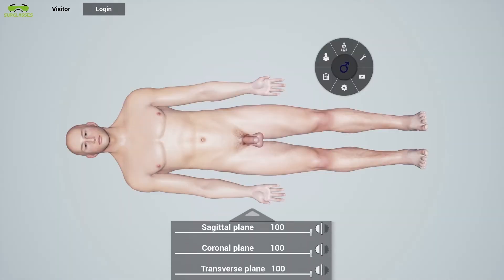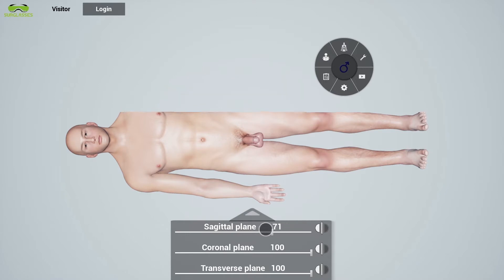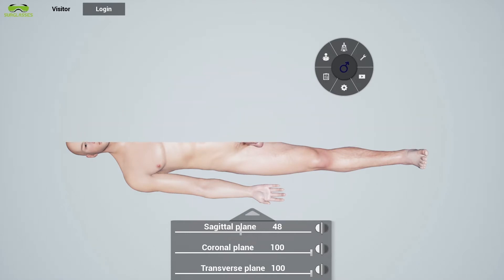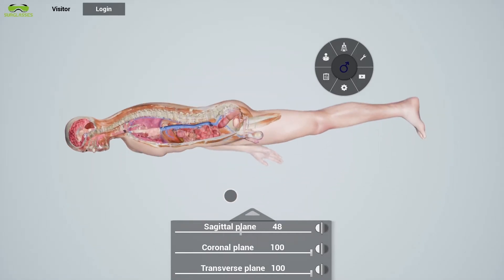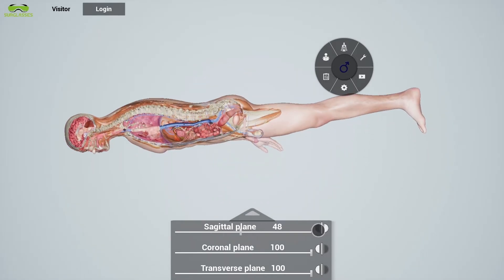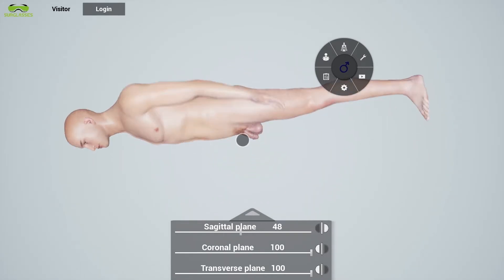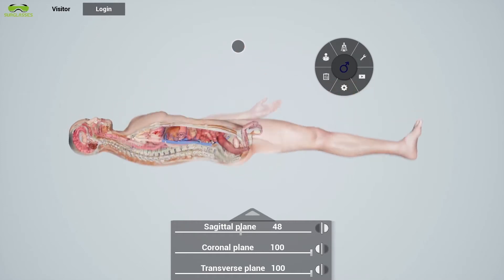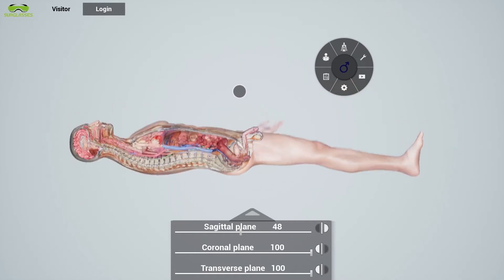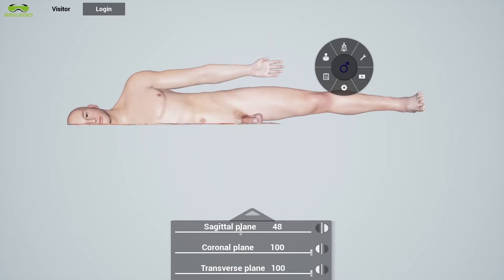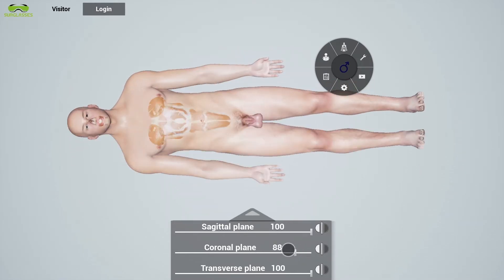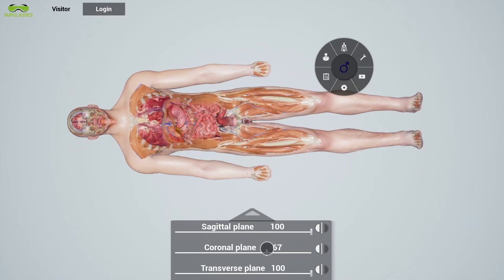The virtual human can also be viewed in three planar views: sagittal, coronal, and transverse.